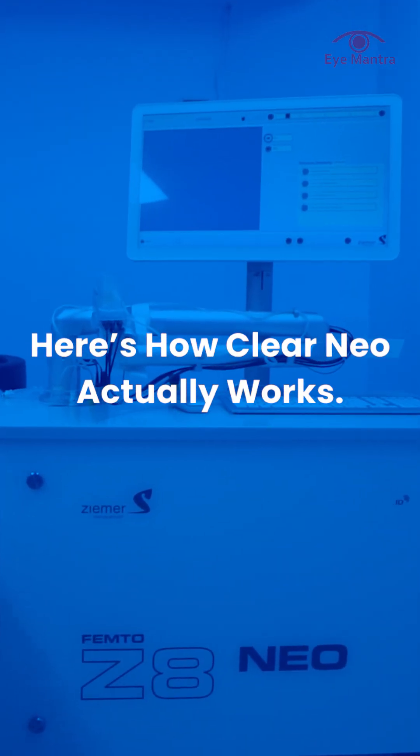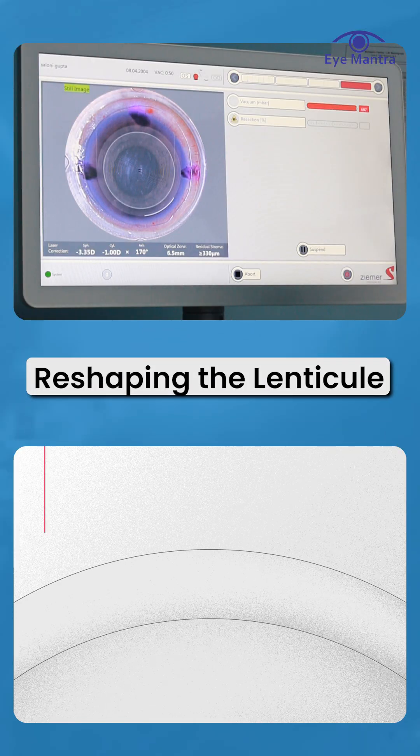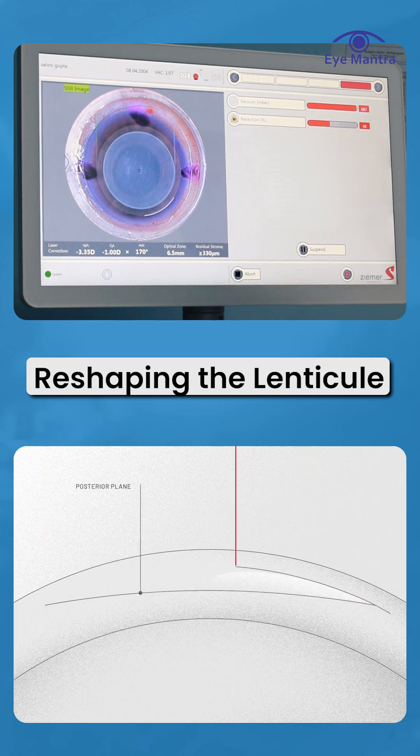Here's how Clear Neo LASIK actually works. Step 1: Reshaping the Lenticule. First, the laser sculpts a tiny, lens-like layer called a lenticule inside your cornea.